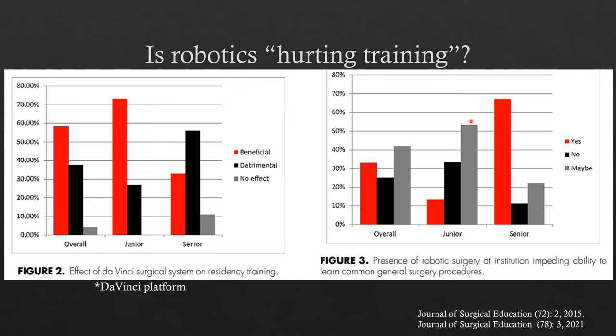It's a very, very different thing. And in terms of the quality of resident education, I think it's just a different skill set. I don't think it will affect resident education very much, but it potentially creates the possibility of losing the anatomic knowledge that you have to develop in order to do this all freehand. Because you should be comfortable doing it; this is just a tool. If it breaks, I wouldn't say you should cancel your case. You should keep going, unless it's something really crazy.